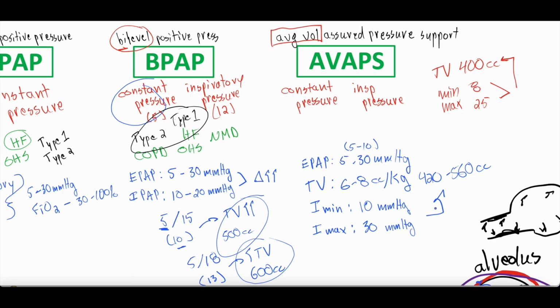They might not want that tidal volume on every single breath, or they might want a little bit more on this breath, a little bit less on the next breath. So it helps read each patient and individualize it to that patient, rather than on every breath pushing in the same set standard pressure to try to get them to breathe. So it's a little more comfortable in that sense.